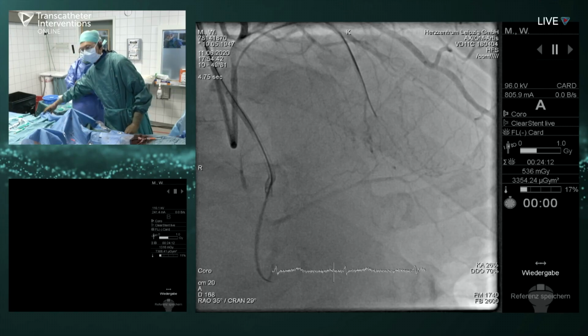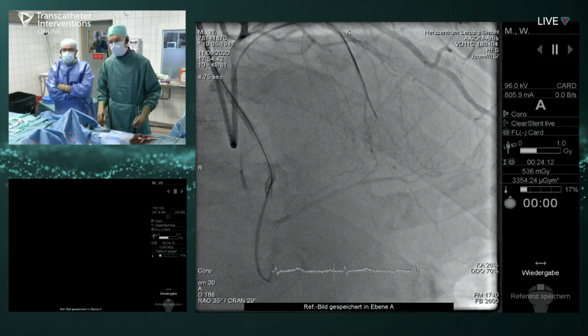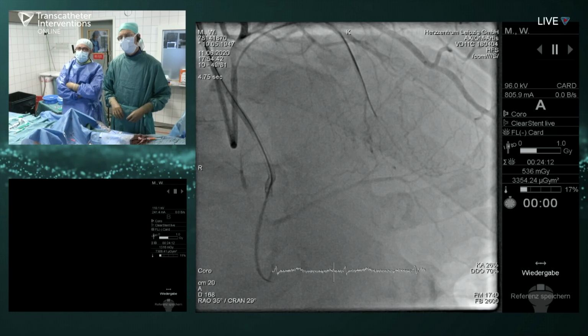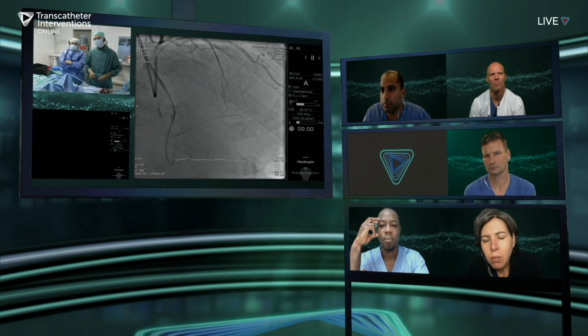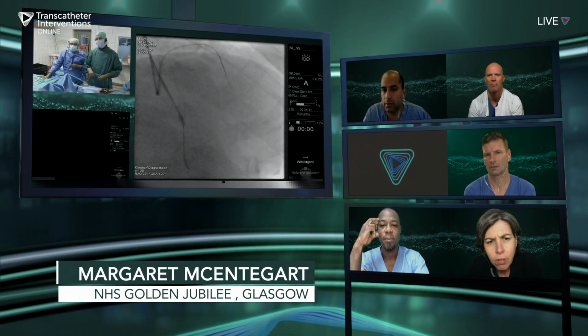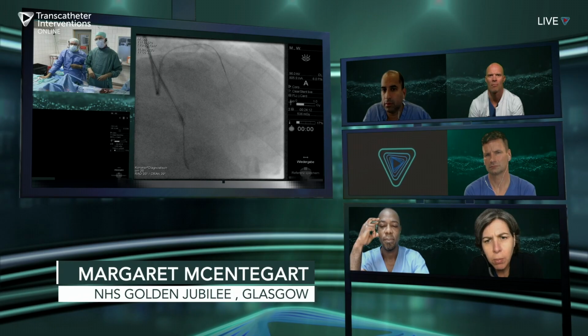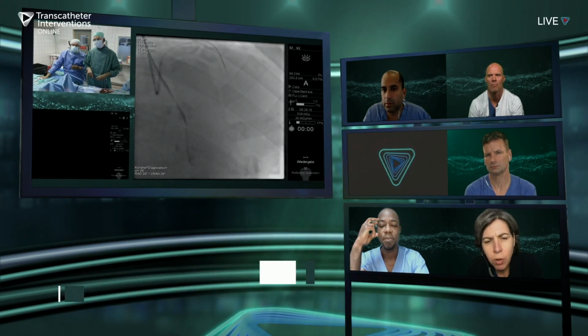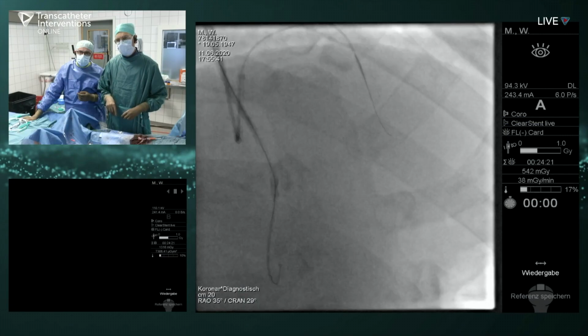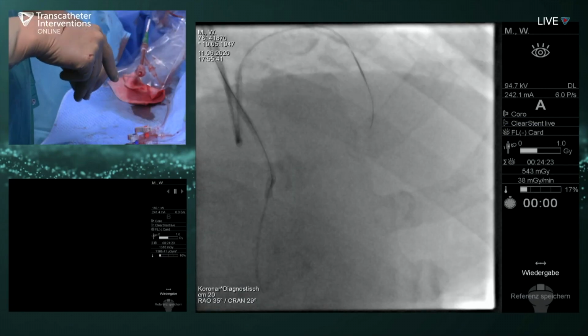This is a good example of robust collaterals, but down lower in the septum, they become very, very tortuous. So sometimes these can be maddening. Margaret, is there any one in particular you think would be best to surf in this case? Obviously they're in a branch that looks like it's got 3 distal forks. The first one looks bigger, but looks quite tortuous. The one that they're in looks like it goes slightly more apical and then back round. I think I would explore the one that I was in here and see if that flips back.